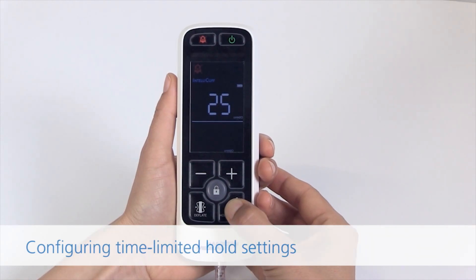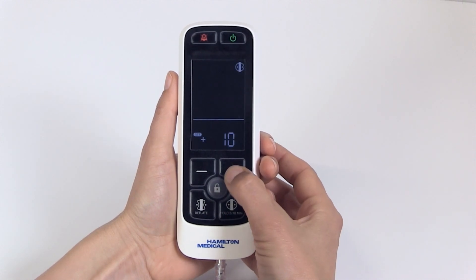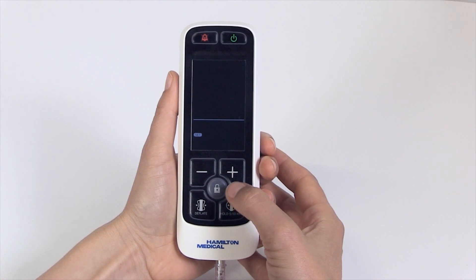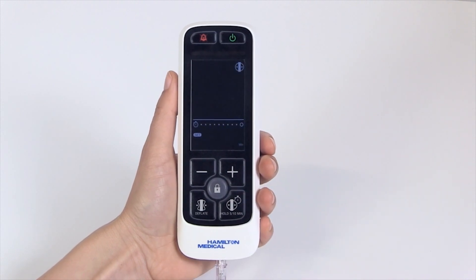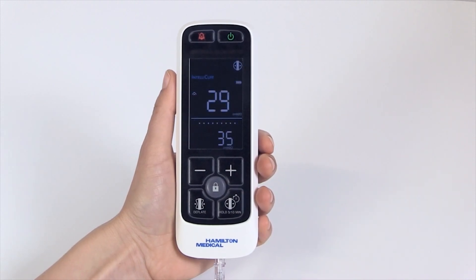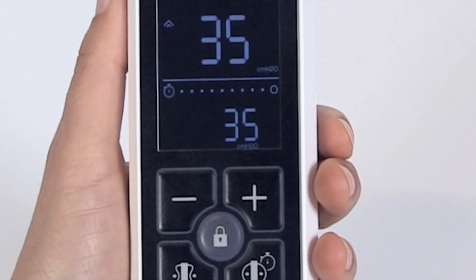Configuring time-limited hold settings. Long press the hold button. Use the increase or decrease button to change the amount of pressure applied above target pressure during a hold. The display value changes to minutes. Use the increase or decrease button to change between the hold times of 5 or 10 minutes.